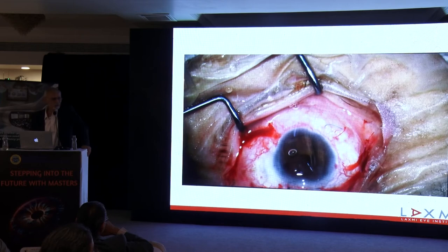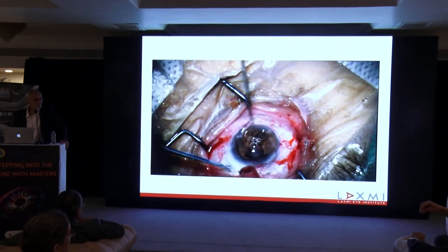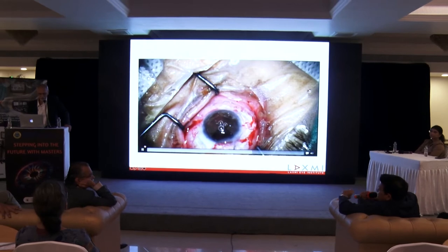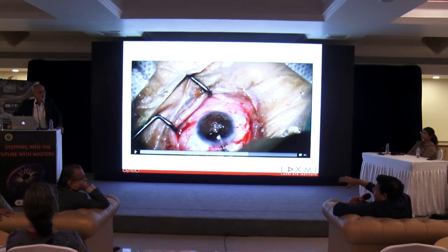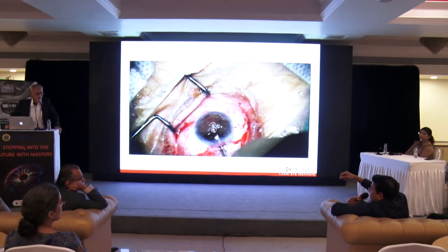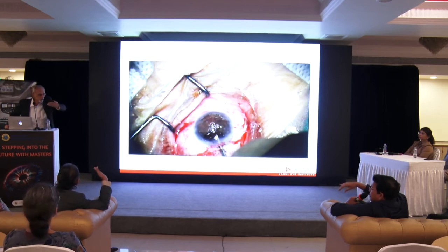Right. When DC also mentioned it, you have just cauterized the other tip which was exposed. Could you have just cauterized that exposed tip so that it just shrinks and goes inside, and at least as a primary procedure you could have tried this? Your main concern was that the tip was exposed and that could act as a conduit for infection. If you just cauterize that tip and allow it to shrink and go inside the sclera, maybe that would have been a simpler surgery, and whether it would have still been tilted.